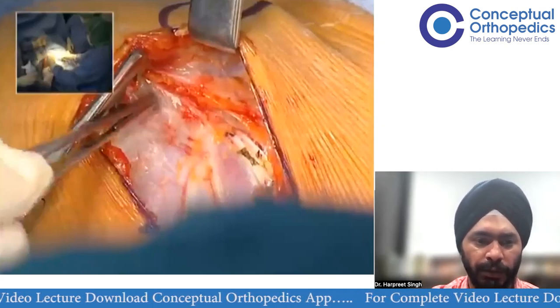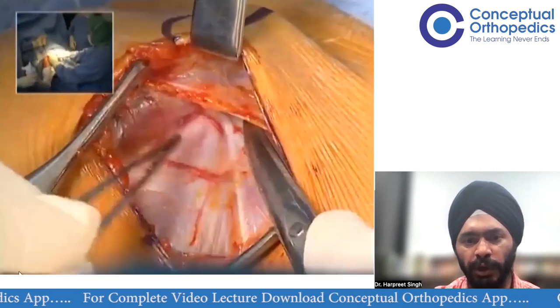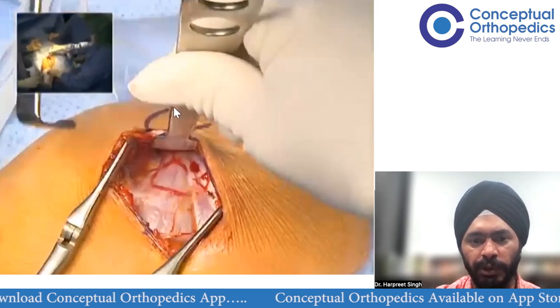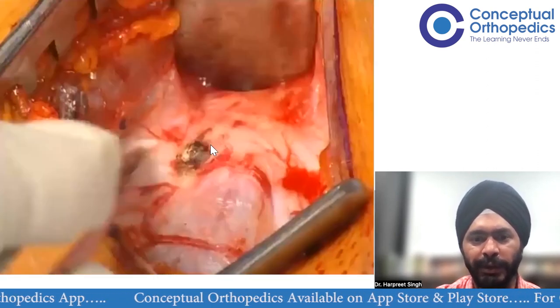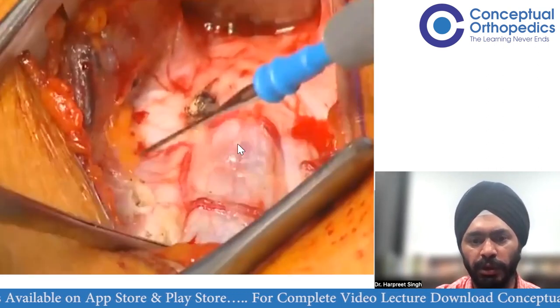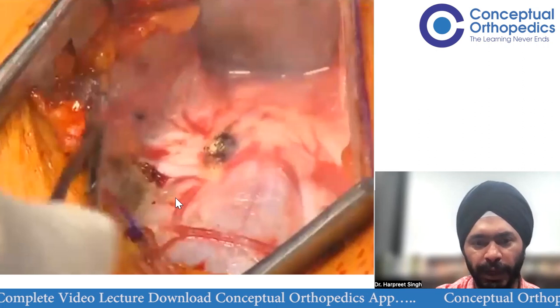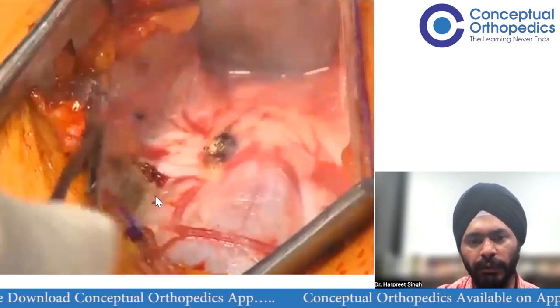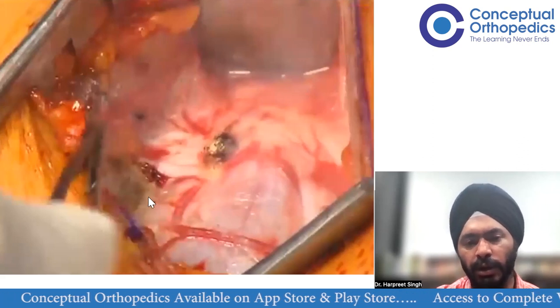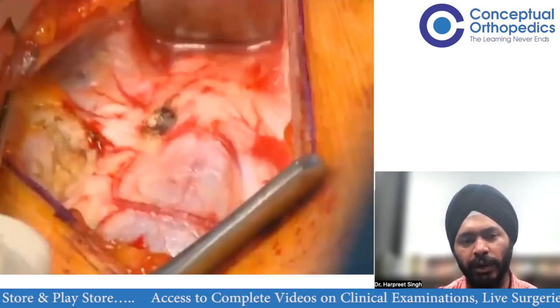Take the cephalic vein laterally along with the deltoid. As you take it laterally and externally rotate the arm a little bit, you should be able to see the conjoint tendon arising from the coracoid. Walsh is putting his hand above the coracoid — this is your conjoint tendon seen beautifully, and this white structure is the coracoacromial ligament. For the conjoint tendon: you dissect lateral to the muscle of the conjoint tendon — not lateral to the tendon itself, but lateral to the muscle. You then see the coracoacromial ligament right there.